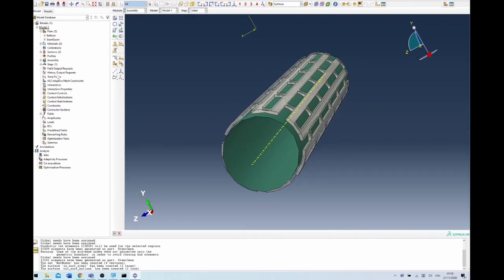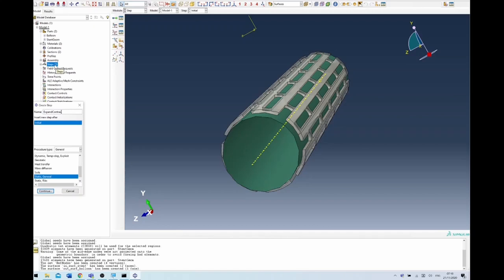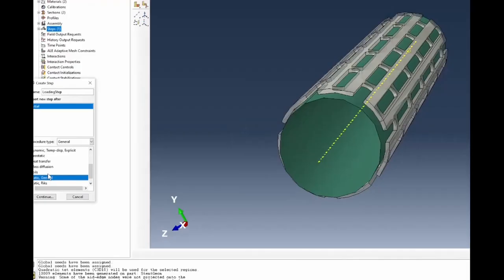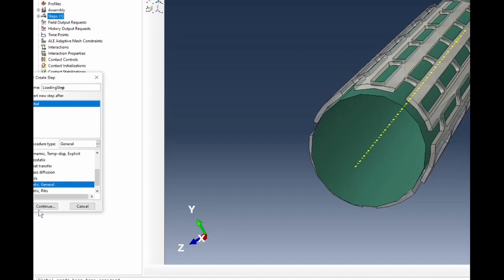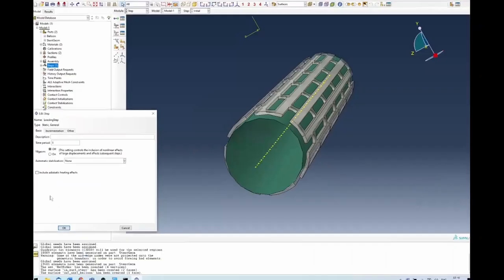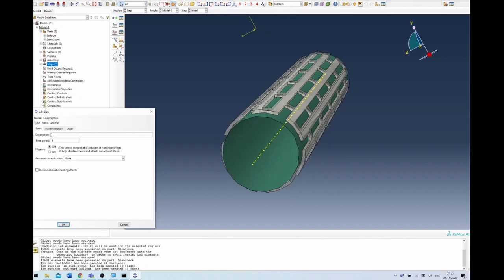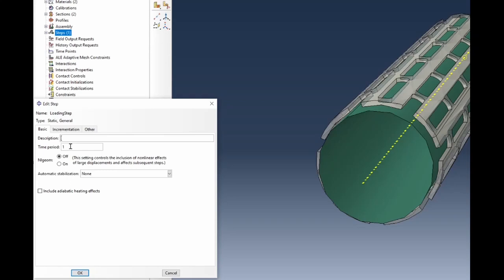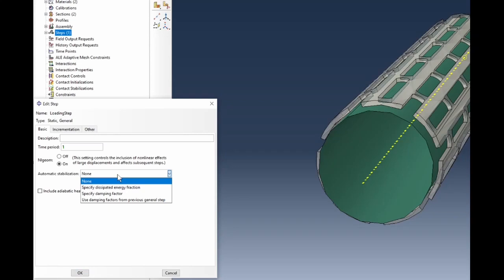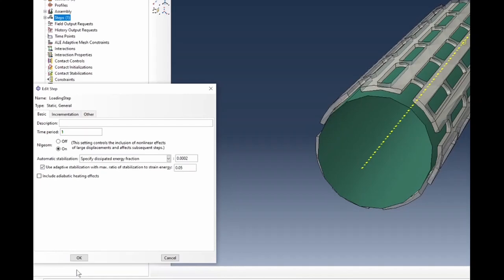Now let's create a step file for this expand-contract loading. I'll call it 'loading step,' use static general, and click continue. In the window, I'll leave the time period as 1. The most important thing is to set the nonlinear geometric control to ON, because the deformation associated with this is quite high. Accept everything else at default and click OK.